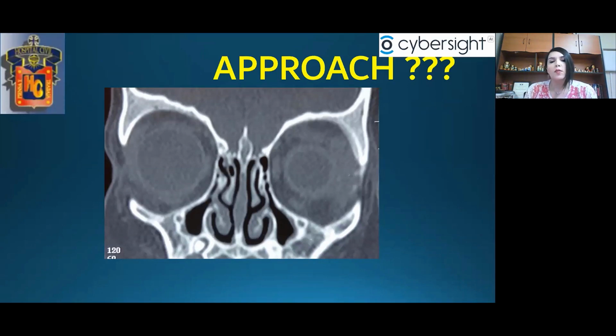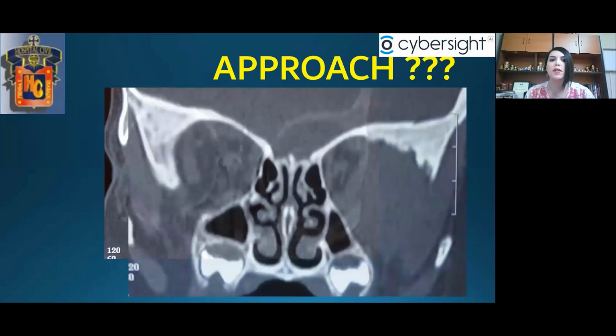So in this tomography, in coronal projection, we can see here the tumor is involving and touching the eyeball, and the temporal wall is eroded. So we have to be very careful because we have a really short story. We have a 2-month story, and now with 2 months, we have the temporal wall eroded. So we must hurry up with this patient.